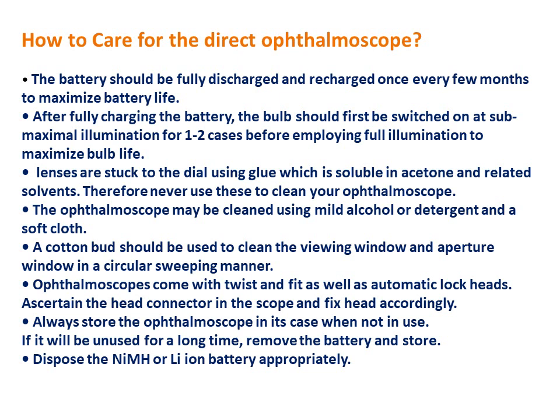The battery should be fully discharged and recharged once in every few months to maximize the battery life. After fully charging the battery, the bulb should first be switched on at sub-maximal illumination, because if you suddenly raise the illumination it may burn and the cost of the bulb is very high.